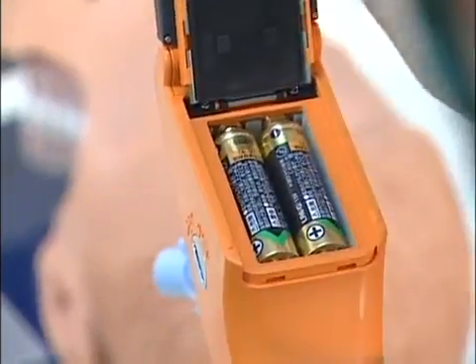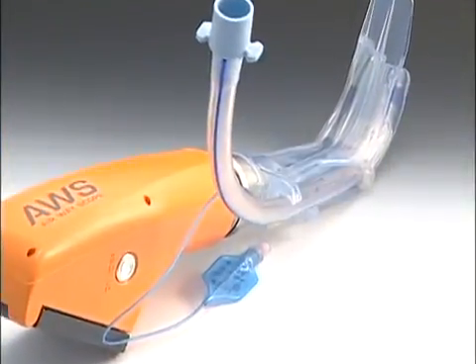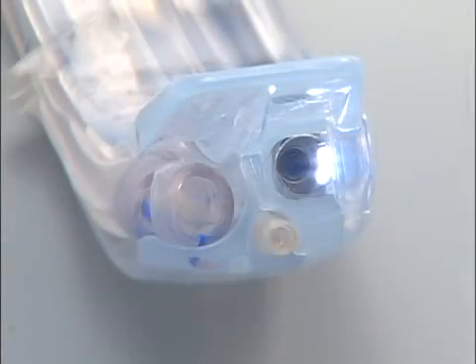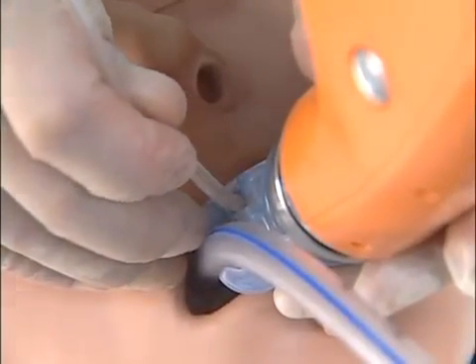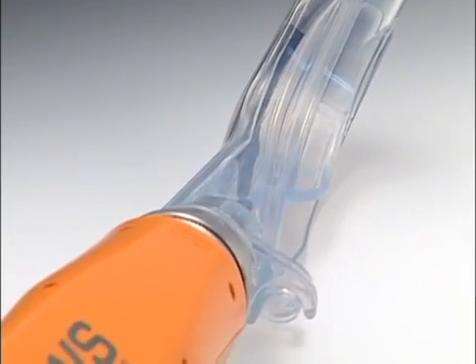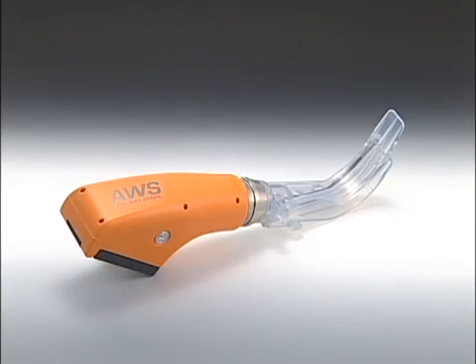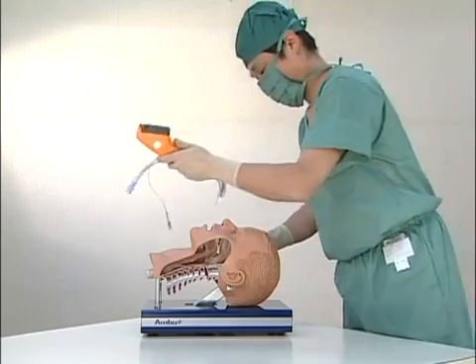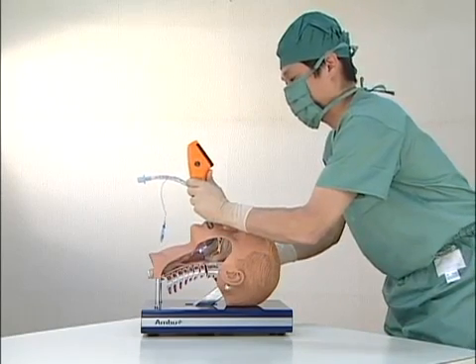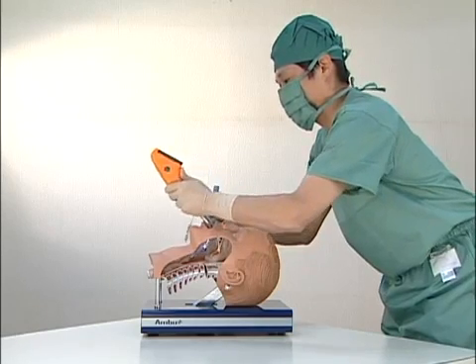You can operate the Pentax AWS continuously for up to an hour using ordinary batteries, and it is waterproof. You don't need a stylet, because the P-blade, a laryngoscopic blade, has a guiding groove for tracheal tubes. You can aspirate using the channel provided for suction catheters on the scope body. The P-blade is disposable and completely sterile. With Pentax AWS, tracheal intubation and suction catheter insertion is now quicker and safer. The Pentax AWS and its adjustable monitor help improve intubating safety while easing the burdens on operators.